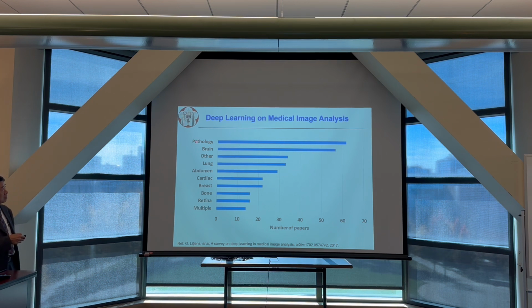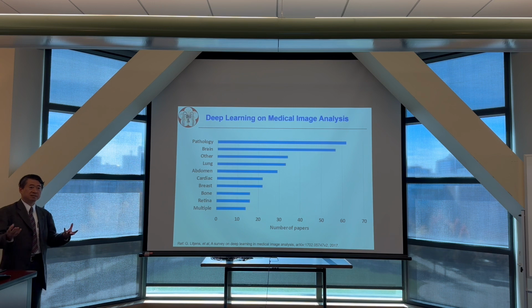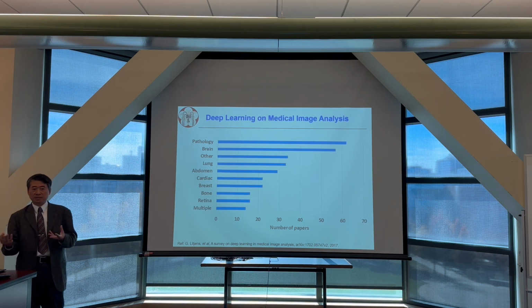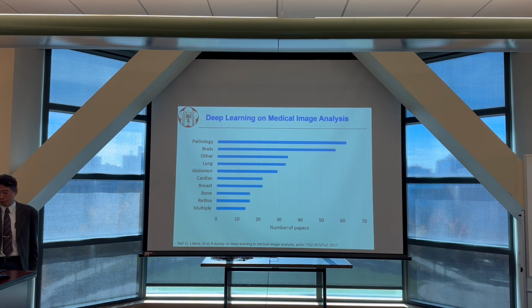And for pathology, usually people care about the resolution. You want to see the detail of human tissues, the nuclei, the density of the nuclei, the shape of the nuclei, and whether the nuclei have a smooth boundary or a very rough boundary. You need a high resolution.